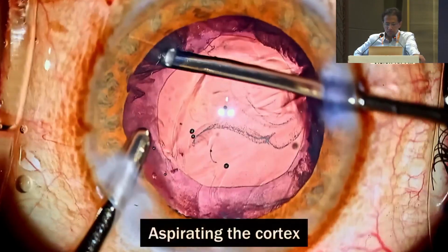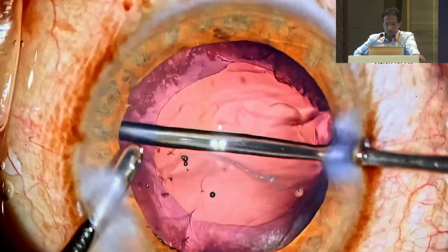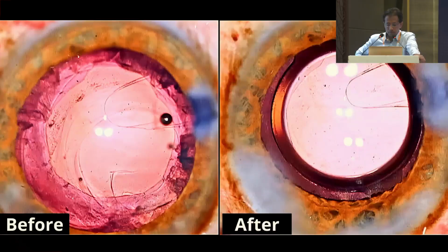Once the vitreous is cleared off, the cortex is aspirated, and at this stage the PC tear has not enlarged. The originally planned intraocular lens is placed into the bag. Our goal of preventing the posterior capsule tear enlargement could be achieved.